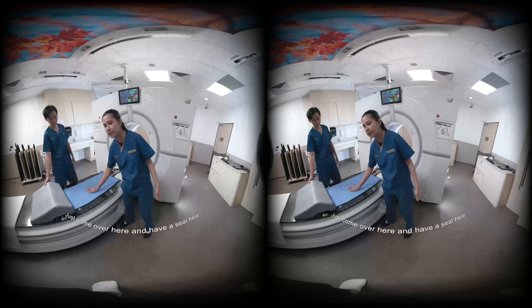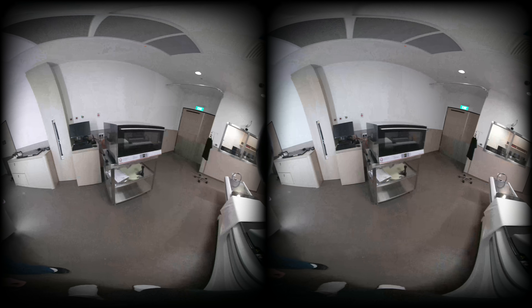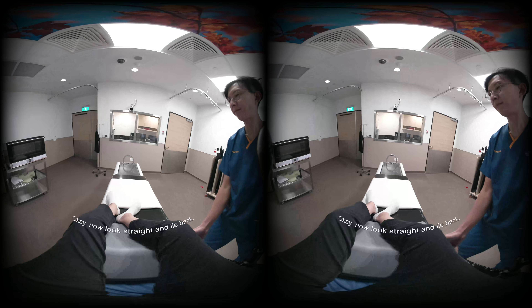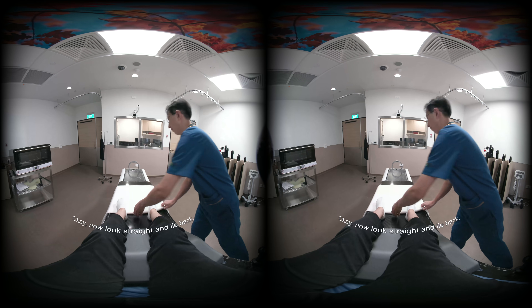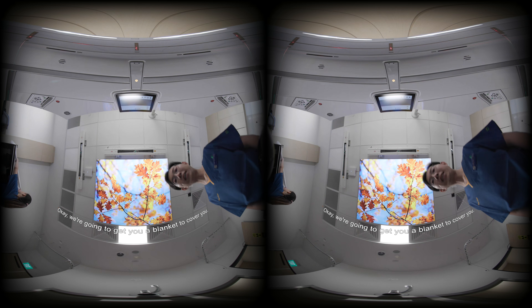Just come over here and have a seat here. Slowly. And just swing your legs up. Now look straight and lie back. We're going to get you a blanket to cover you.